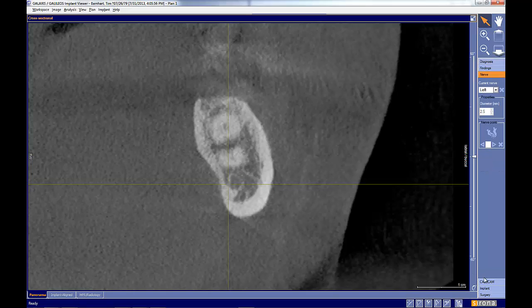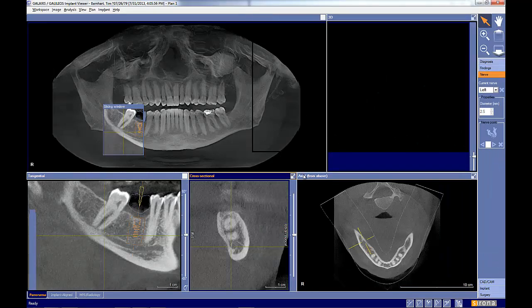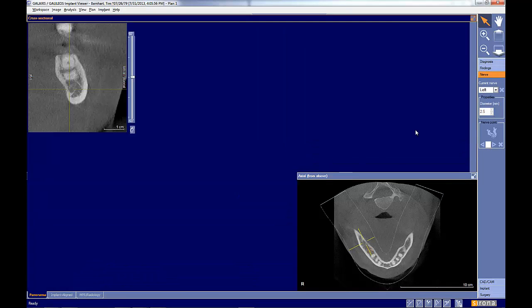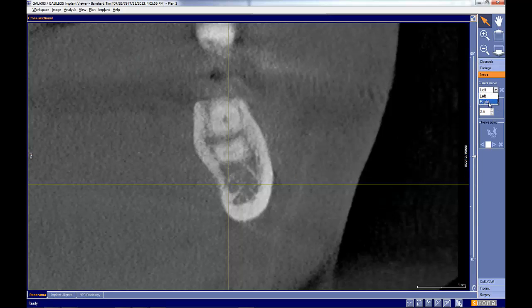So now we'll go to the nerve tab. Basically what we'll do here is we'll just mark the nerve and move through. We're going to be working on the right hand nerve. Make sure my license is there. And again, you see that was grayed out, so the license wasn't available. Simply come down here, click the license. So now we have the nerve point. We're going to go ahead and double click in the center of this area.